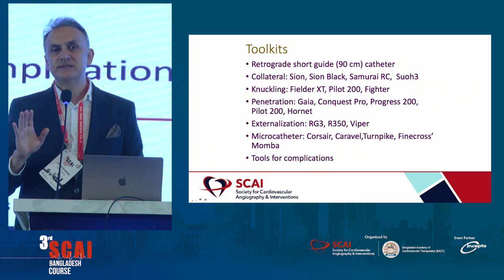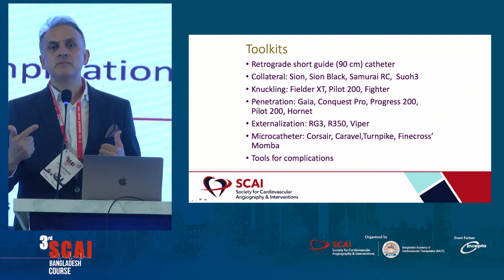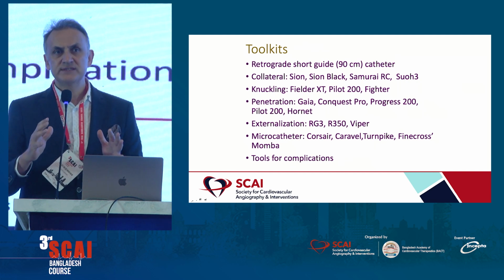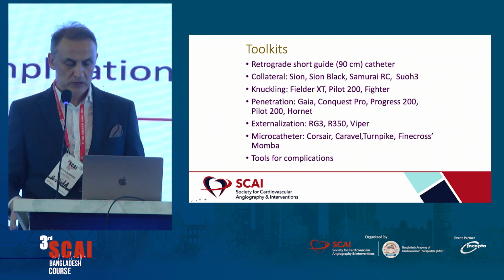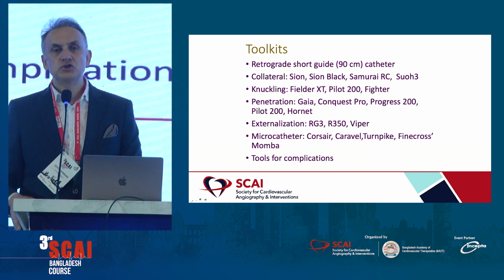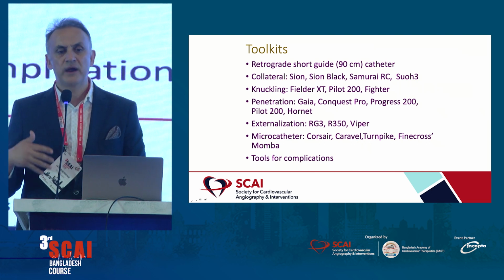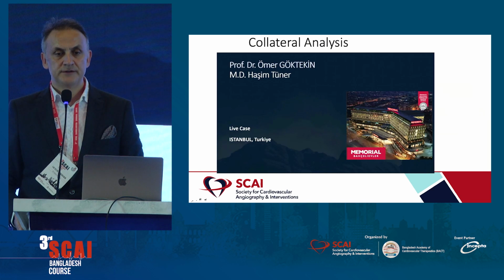We have to have some toolkits. We should have different retrograde wires. We should definitely have some coils or other devices, if we have any perforation, to seal the perforation. And we should have all kinds of wires, penetration wires and other wires, and of course microcatheters.